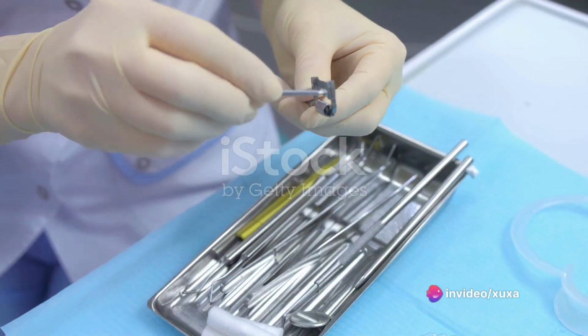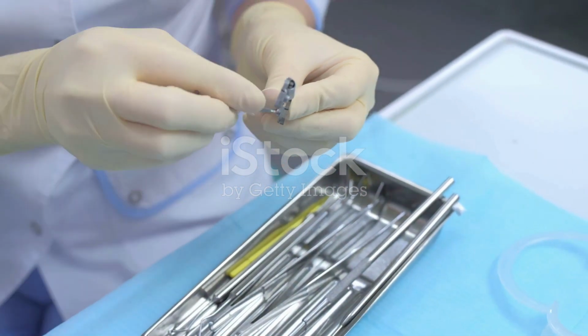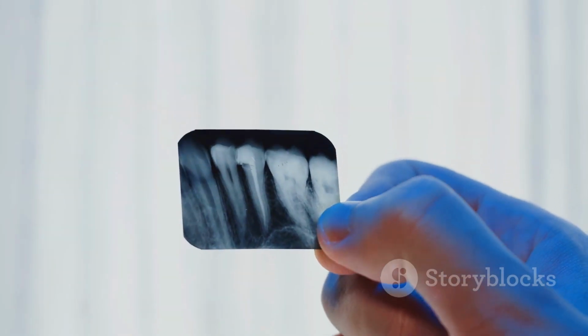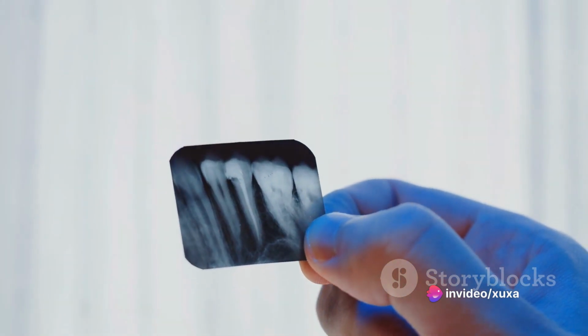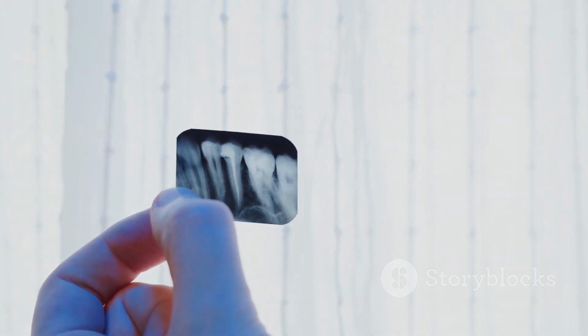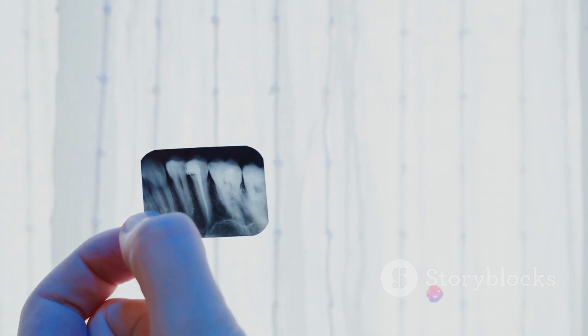Therefore, practical training on extracted human teeth and a strong emphasis on biosafety and the proper use of protective equipment are recommended for beginners. Before coronal access, a thorough clinical examination and periapical radiographs are essential. Periapical radiographs using the parallel technique can aid in planning the access. Factors such as tooth inclination, caries, pulp horn locations, and calcifications play significant roles.